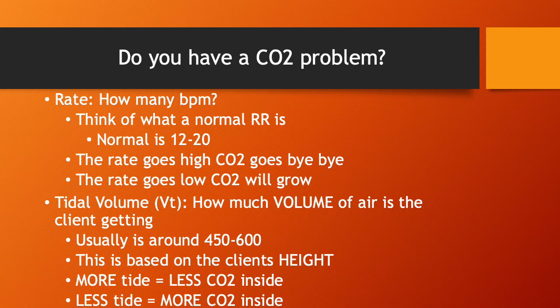And I have this little rhyme here, the rate goes high, CO2 goes bye-bye. And what that means is that the higher my rate is on the ventilator, so let's say that I had a patient with a rate of 22 or something like that.